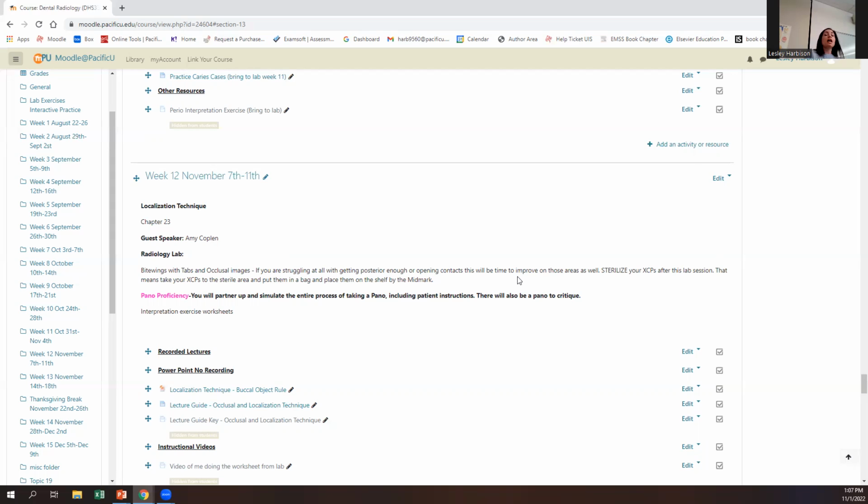If it's like luck that you get it done half the time, really try to hone that skill so that you're consistent with it, because once you're into radiographs on live patients, that'll be a big thing that they'll notice. If you're closing contacts on patients, they're going to notice that. So make sure you really grasp that concept of utilizing the Q-tip and how it's working out.